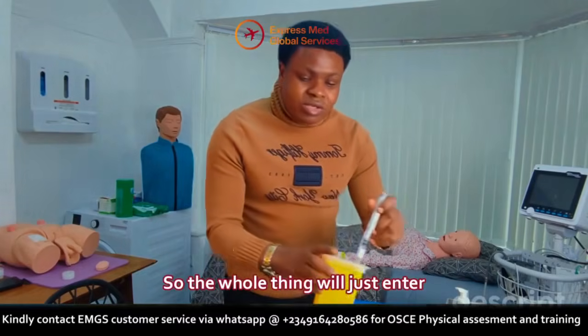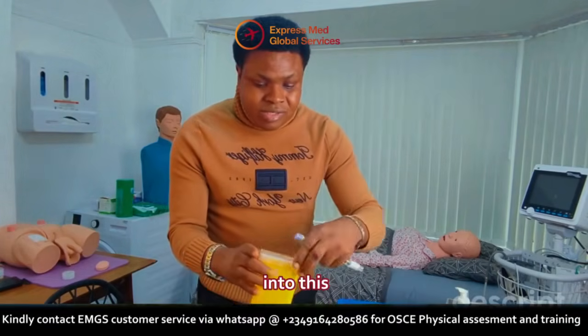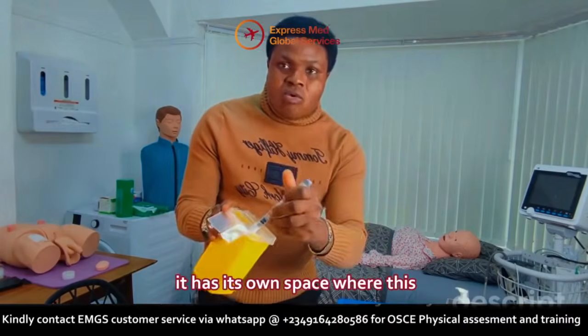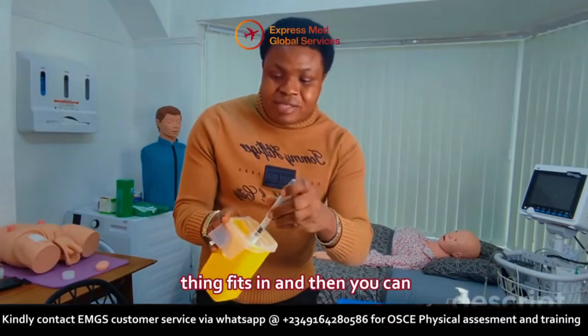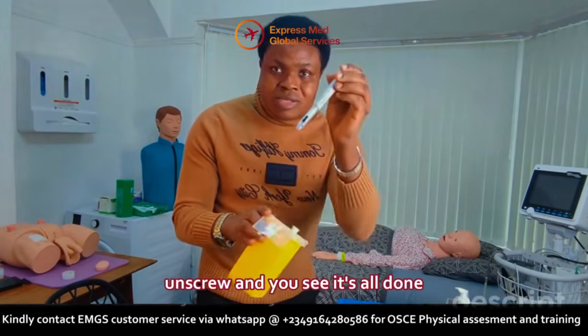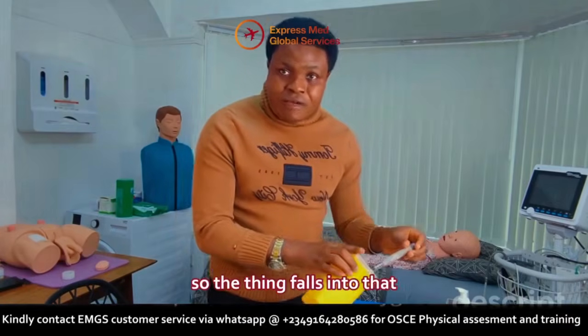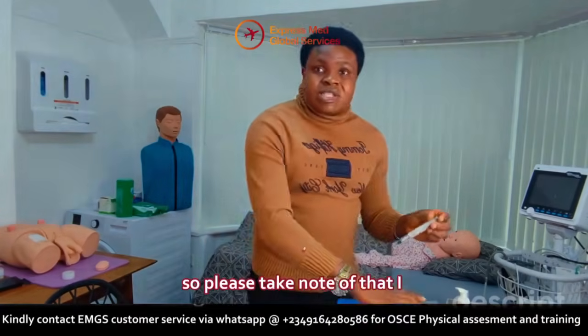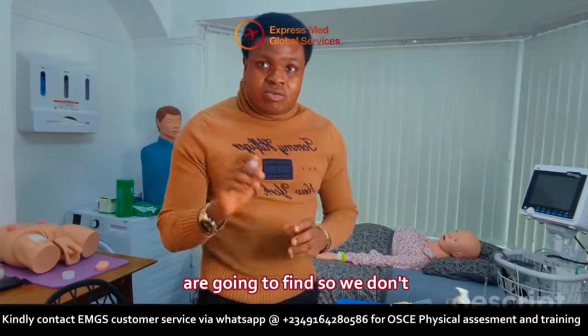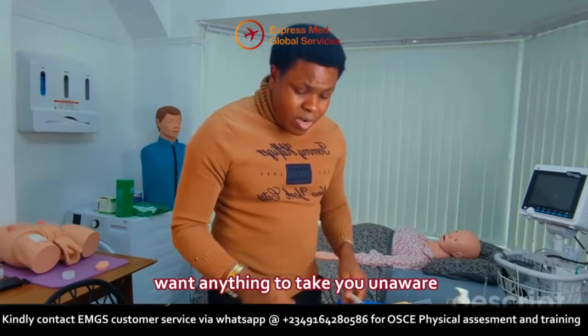So the whole thing will just enter into this. This has its own space where this thing fits in, and then you can just unscrew, slowly. And you see, it's all done. The thing falls into that. So please take note of that. You don't know the type of sharp you are going to find, so we don't want anything to take you unaware.